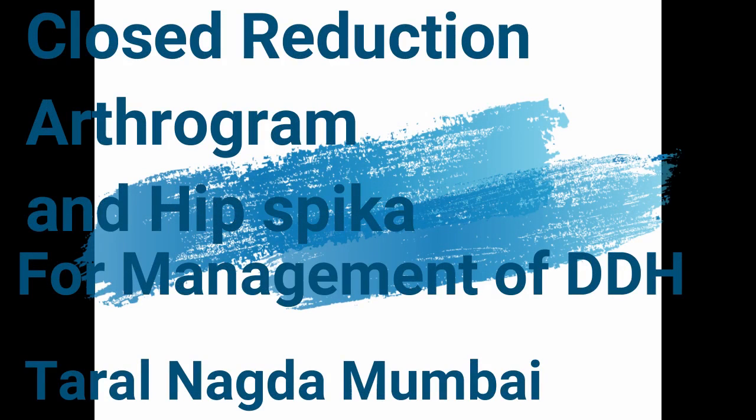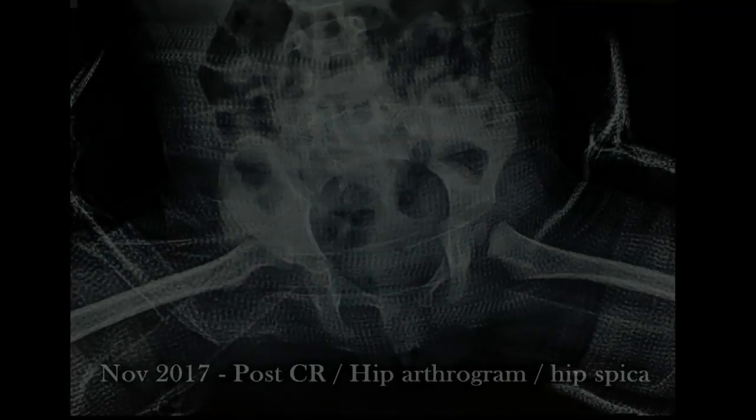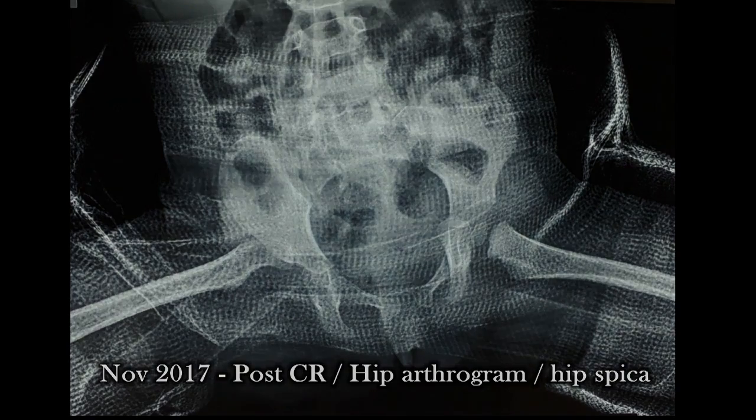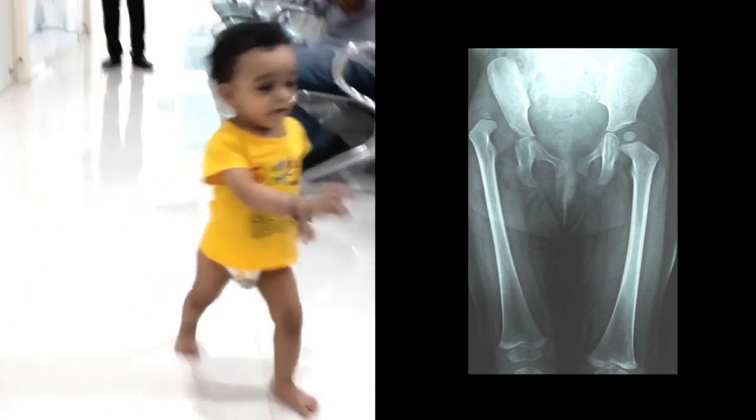This video covers Closed Reduction Arthrogram and Hip Spica for management of DDH. This is a 1-year-old child with DDH. Hip Spica and Arthrogram was tried for her but it failed. Now the child is 1 year and 3 months. This is how she is walking, with a limp on the right side.